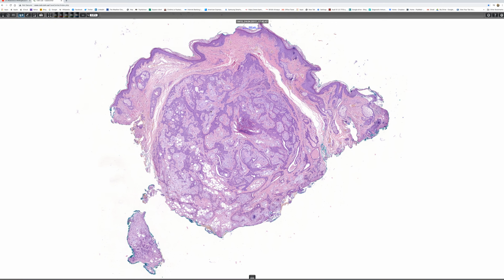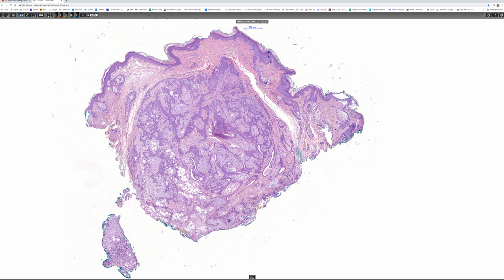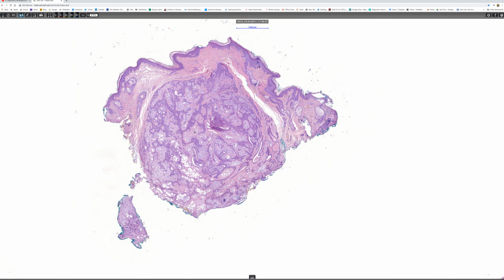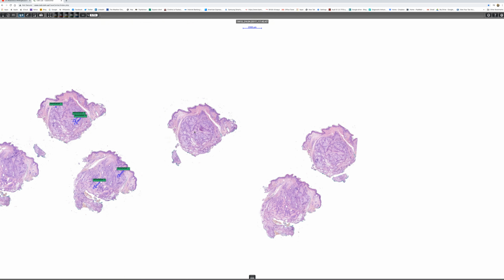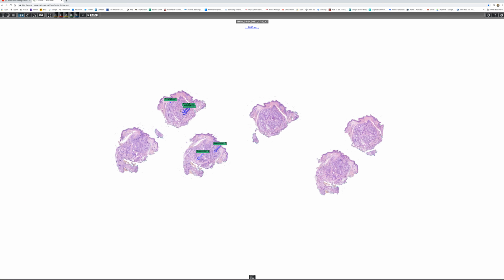I don't think so. Just to me, mixed tumors are an H&E diagnosis, and I don't see any need for doing any immunohistochemistry. But if you have a mind to, you can always look at the duct and glandular differentiation with EMA or CEA or high molecular weight keratin, and the myoepithelial cells you can highlight with S100 or smooth muscle actin or calponin. Now I just wanted, what I remember, to touch on atypical hidradenoma.